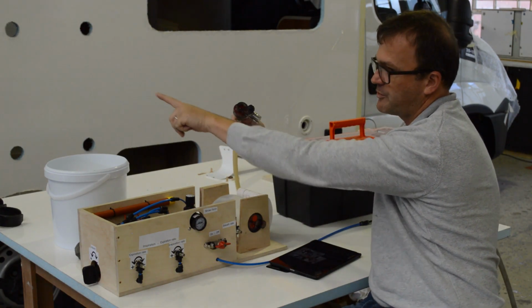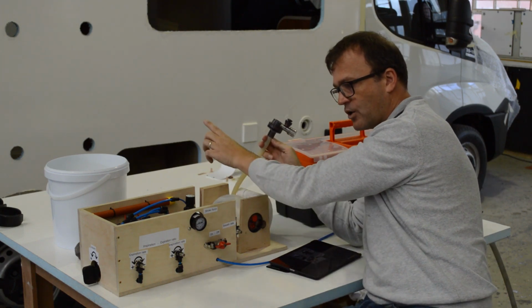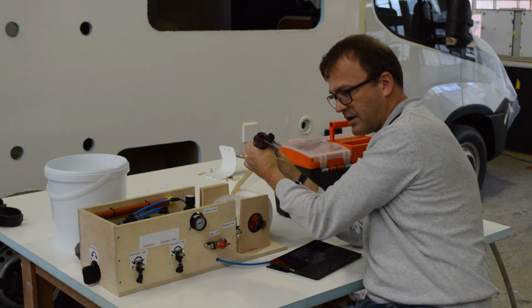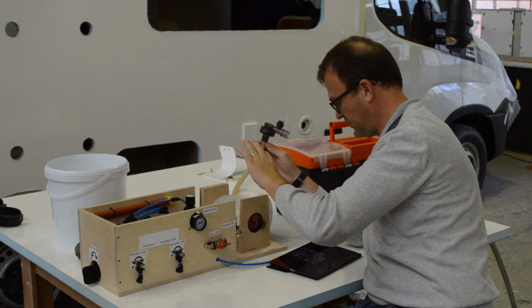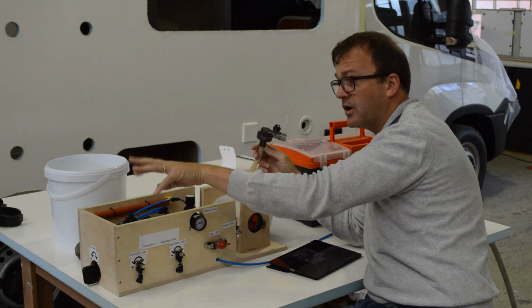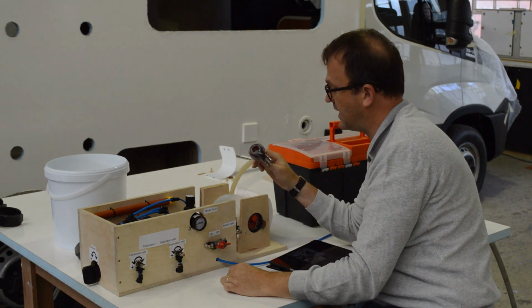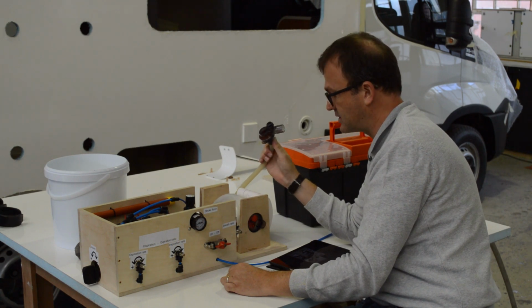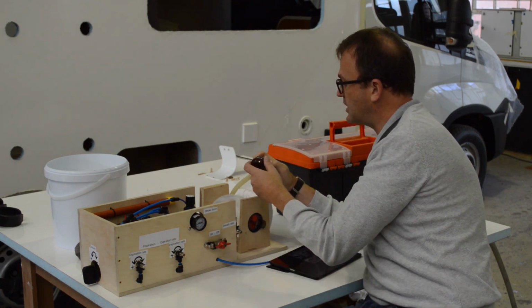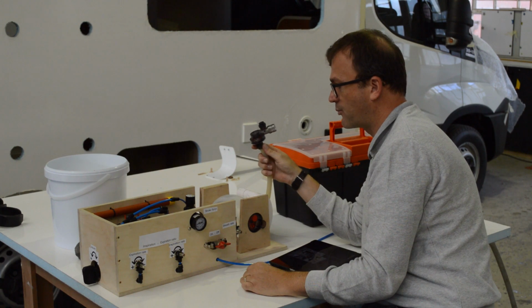Everything after this to the patient will be the pipe to supply the air, and then obviously the diverter. So there will be a diverter on here, which will then scavenge, I don't know how to pronounce it perfectly, scavenge the air out of the window, underneath the tent, get away with it, filter it. Obviously then you can have a PEEP valve on that as well, which will then allow a little bit of pressure on that side, as I've been told. But again, those are details that I am sure medical experts will know. Our primary focus here at the moment was getting air to the patient.